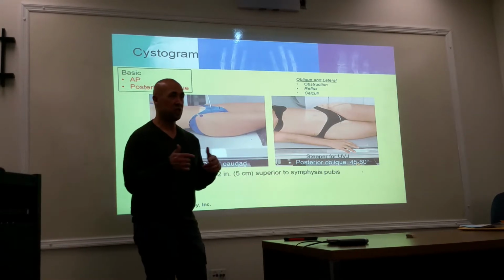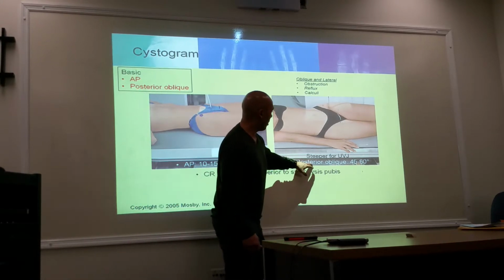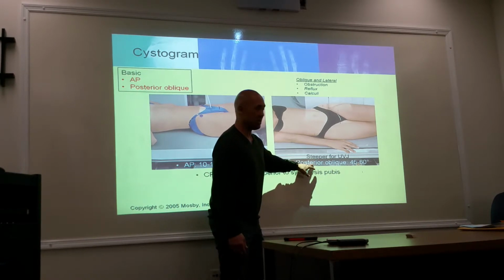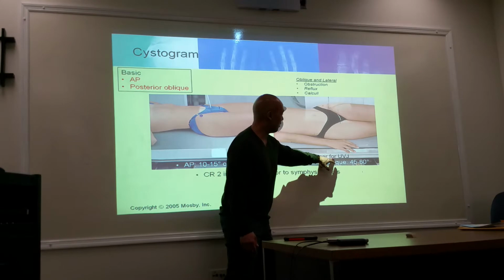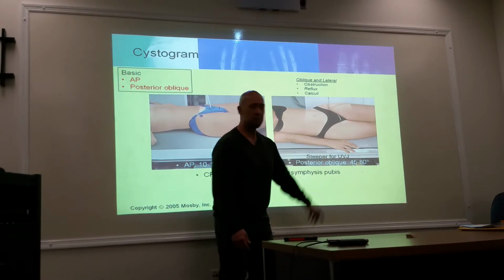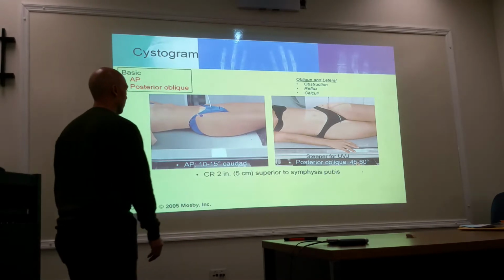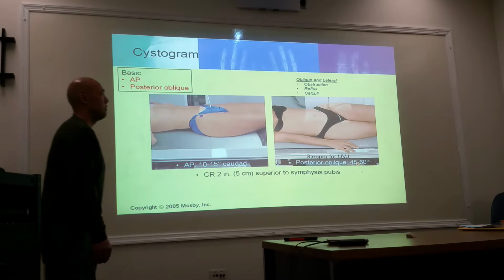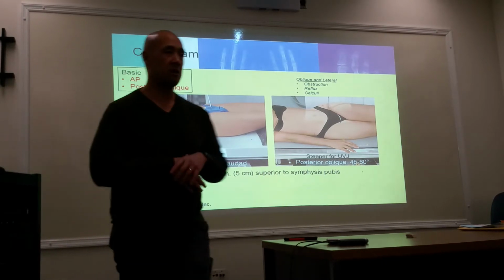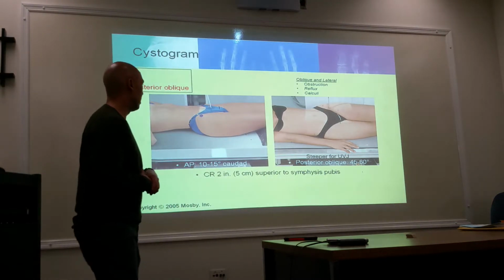Remember the UV junction? It says here that you want to rotate your patient anywhere between 45 to 60 degrees. Steeper angles are good to visualize the UVJ. I don't think that's on your slides. Okay, so steeper angles will better demonstrate the UVJ. And again, collimate to the area of interest. We don't need a large field.